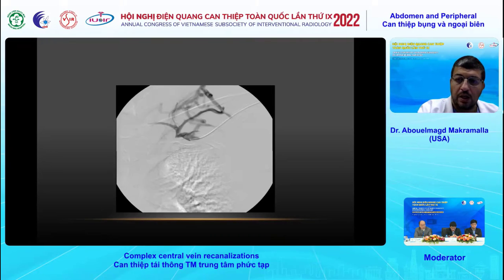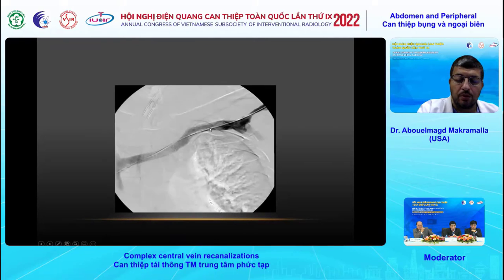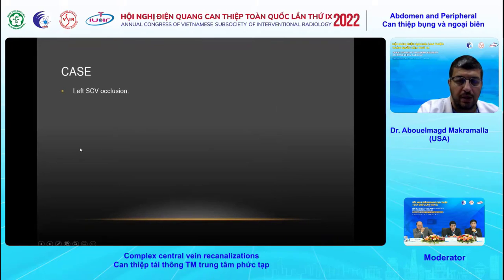So we actually placed a metal cannula from the TIPS set that we use to perform TIPS in the liver, and we obtained femoral access and placed a snare as a target and triangulated it, and then advanced a 22-gauge 55-centimeter Chiba needle through the metal cannula directed towards the snare. We were able to advance a wire, snare it through and through, and then place the covered stent, which maintained patency, and this helped resolve the swelling and the pain.